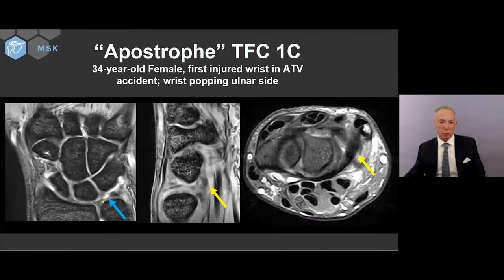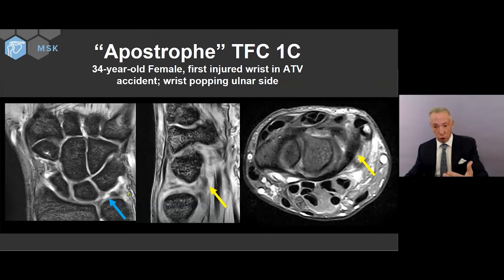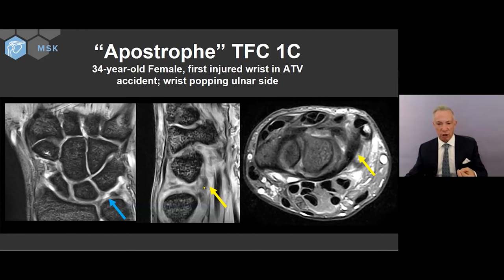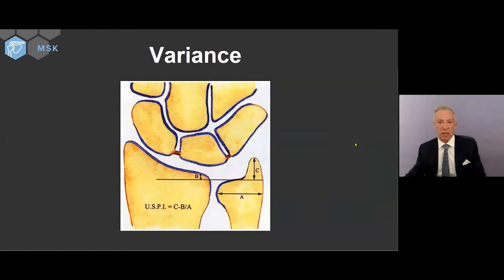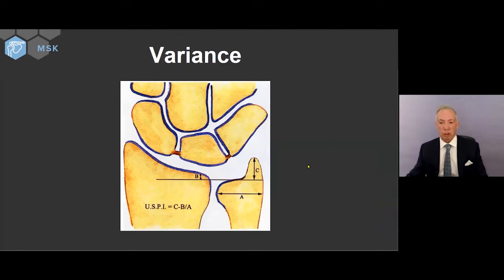Here's another one — a bit more central. This one has a central tear but also a peripheral tear. Here's the TFC with some intrinsic tearing, but there is a fat, chubby ligament going to the triquetrum as part of the TFC peripheral distal stabilization. So the patient has both a central injury and a peripheral/distal injury.